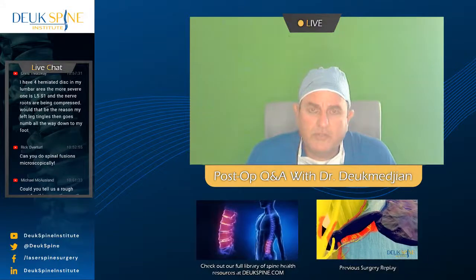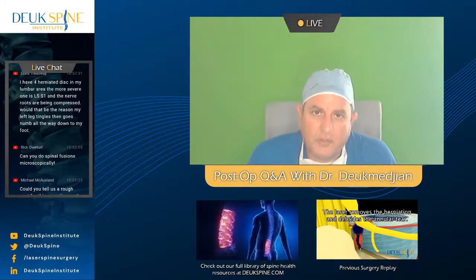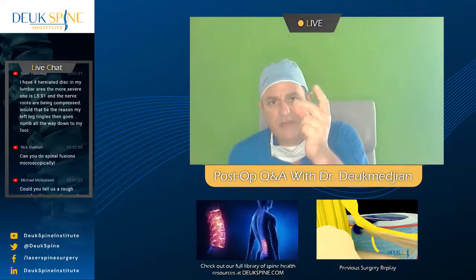The number one reason that people get failed spine fusions is what's called residual stenosis. And residual stenosis means that that hole was not opened up. And the way I open that hole is two things: laminectomy, foraminotomy, combined with Smith-Peterson osteotomy.